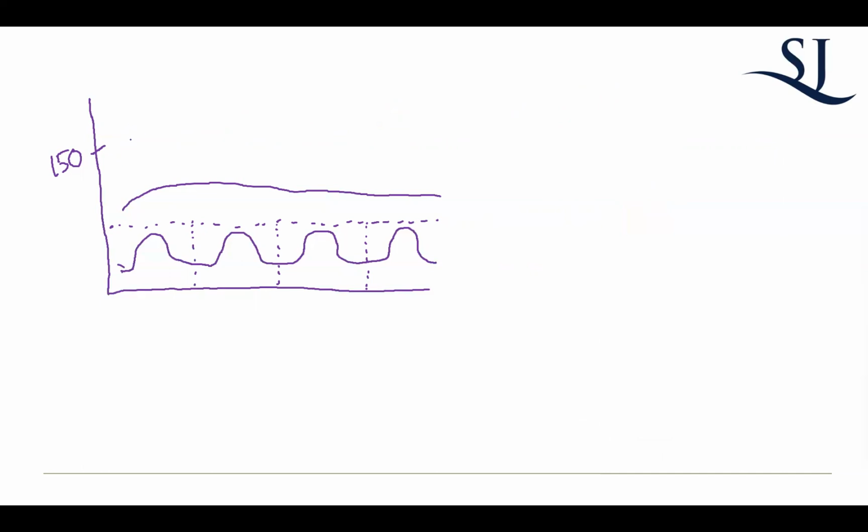So you say, all right, we'll just recheck you in 4 hours. So this happens. So what is this called? When you have that decrease. Good, good. Prolonged deceleration. So you can appreciate, you have moderate variability here, but you have now fetal bradycardia. So what do you want to do?